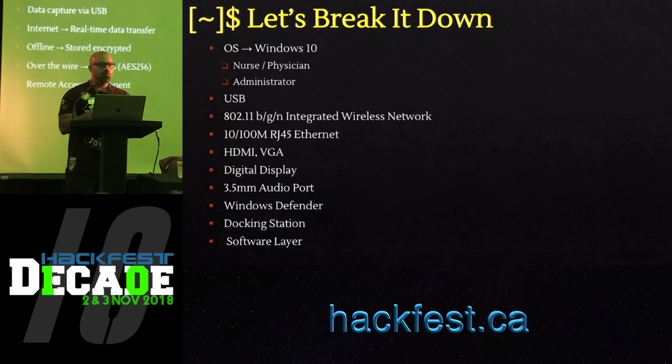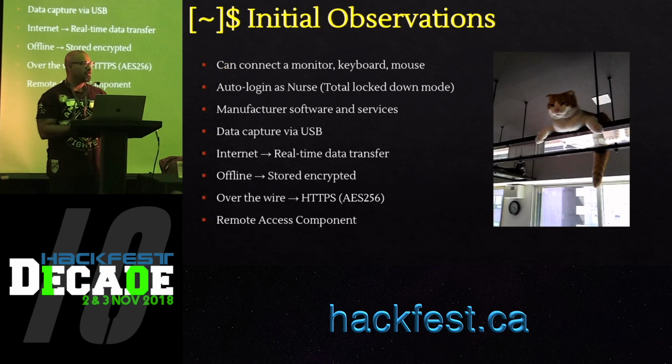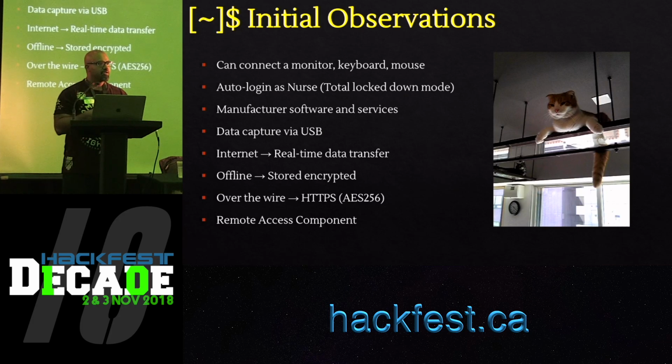We noticed that once you boot up the pen, it automatically logs into the nurse/physician account. So you don't need to provide a username and password. It's pre-configured to log in, but it would log in in a lockdown mode, so you can't really do much with that mode. We noticed a couple of manufacturer applications and services running on the pen itself.